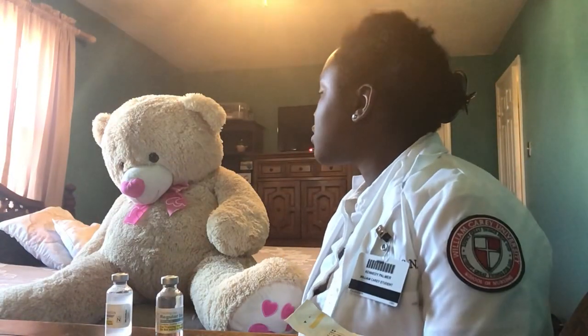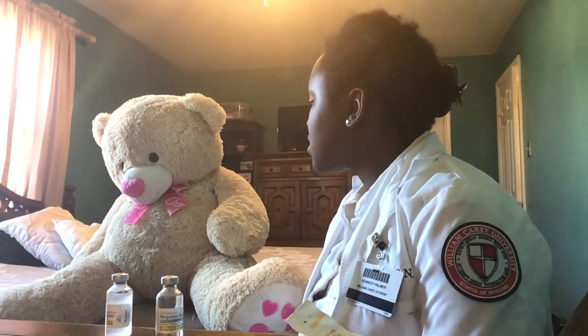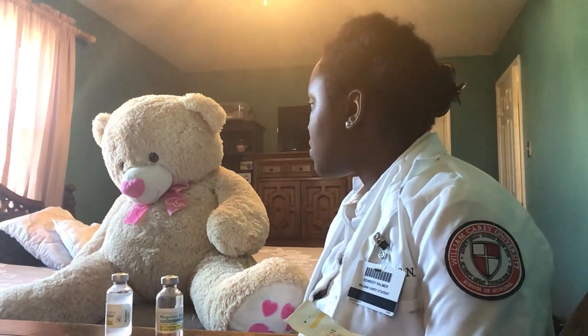Hi, my name is Kennedy. I'm a student nurse at William Carey. I'll be performing your insulin administration today. Can you verify your name and date of birth?